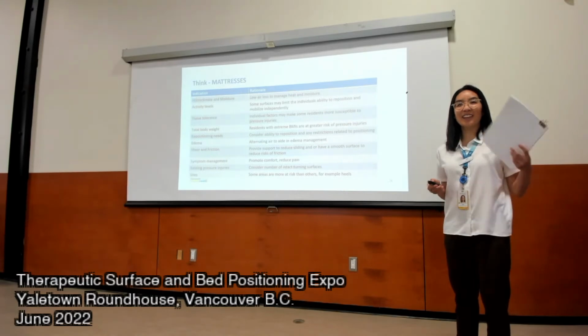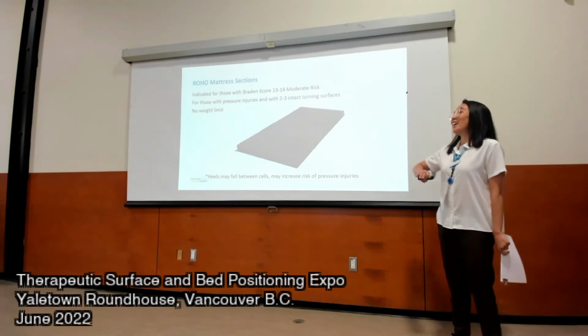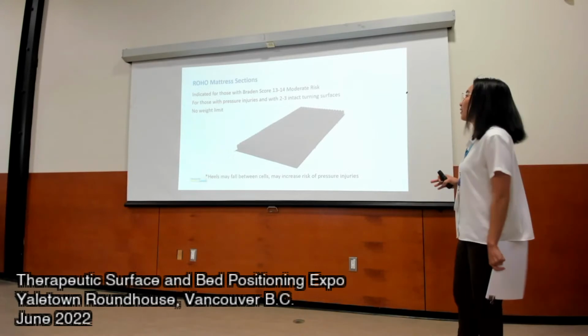Questions? You guys okay? I'm trying to speed through this so you have enough time for the vendors. Rohos. We talk about this because Rohos are in every single long-term care home on chairs and on beds.